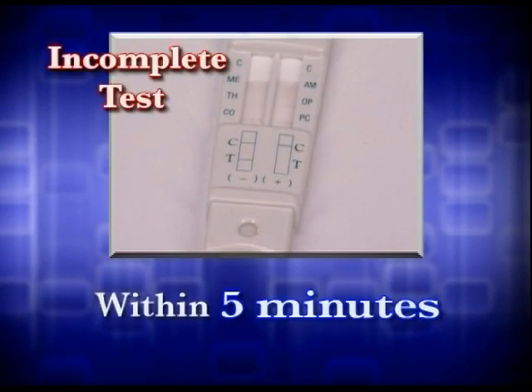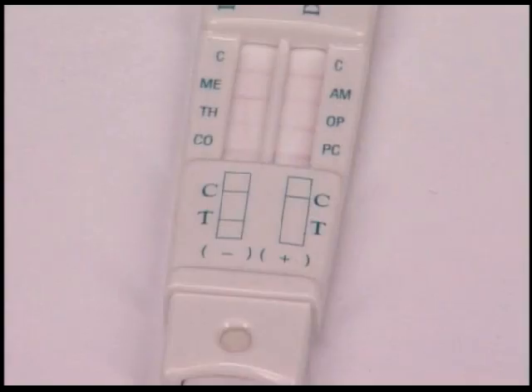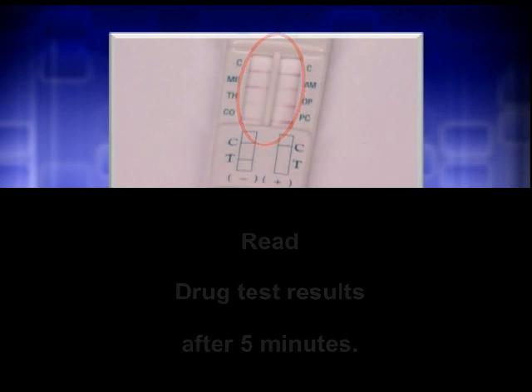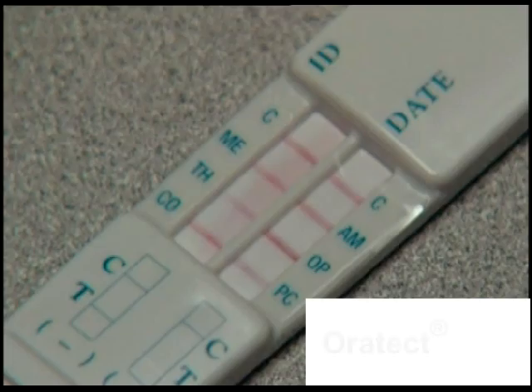If, however, the test has not run to completion within 5 minutes of having the device in the donor's mouth, discard that device and repeat the test using a new device. Once a sufficient amount of saliva has been collected, request the donor to recap the device and lay it on a flat surface. Read results 5 minutes after the donor removes the device from their mouth. The drug test results may be read for up to 30 minutes after the donor takes the device from their mouth. Follow these guidelines to interpret drug test results for both Oratect and Oratect Plus.